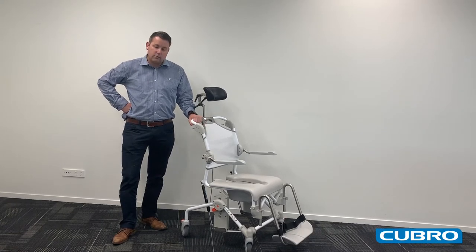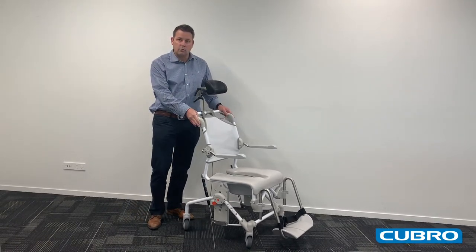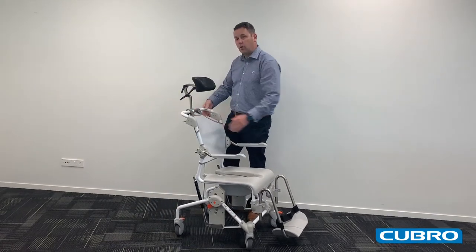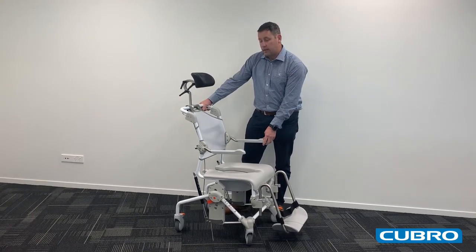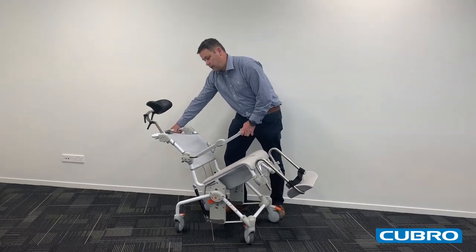The Swift Commode is a compact yet comfortable commode. It has a tilt bar which is accessible from both the left and right hand side of the chair, meaning the patient is supported and the carer can keep eye contact whilst reclining the patient.